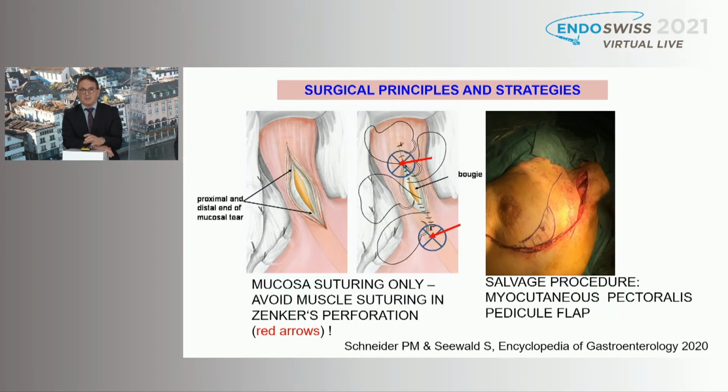Maybe just the principles for you is maybe not so much interesting, but in the esophagus in particular, I show it to you here for perforation in the Boerhaave's position, but the same rule applies for the cervical. So the same rule applies for the cervical, but not for Zenker.